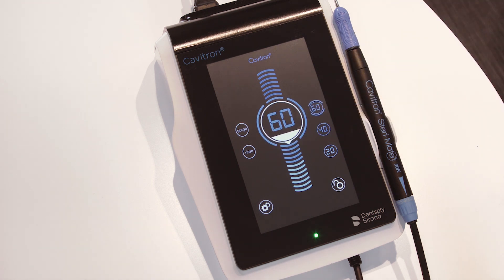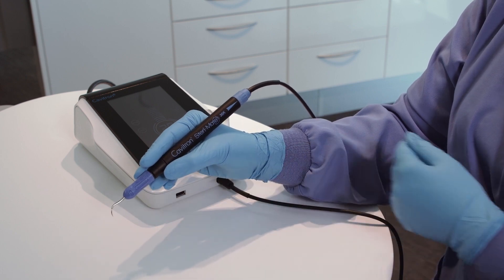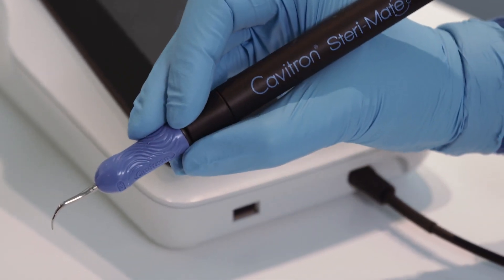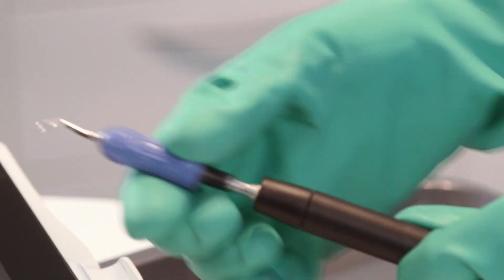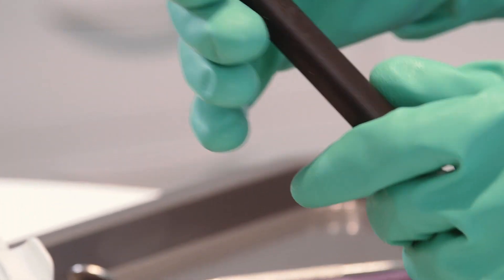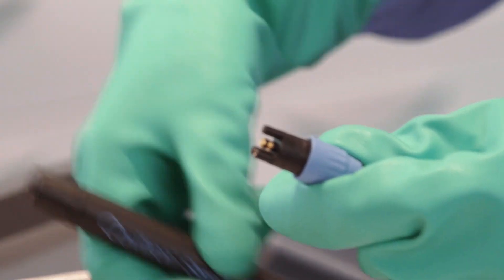It includes customizable memory power level presets for improved efficiency. The Steramate 360 rotating handpiece allows for effortless rotation of the ultrasonic insert during a scaling procedure. This handpiece is detachable and autoclavable, reducing cross-contamination for enhanced infection control.